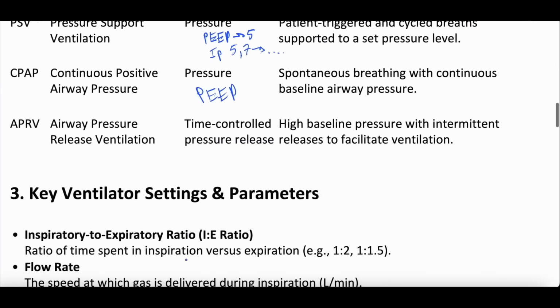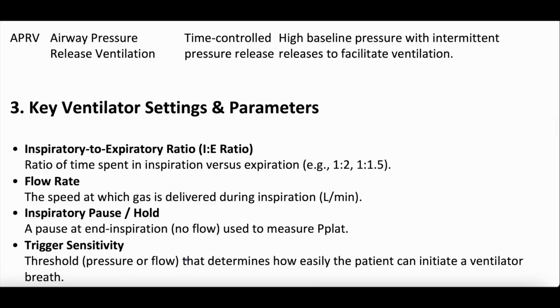All right. Ooh, APRV. This is really complex. We have a whole episode we're putting out on APRV. It will be already out by the time this episode debuts. We suggest you just check out that episode because this is going to be too hard to explain quickly. It stands for airway pressure release ventilation, and it's essentially a time-controlled high pressure with intermittent pressure releases to facilitate ventilation. But that probably doesn't make sense when I just speak it that way. So definitely check out that episode if you have an interest.